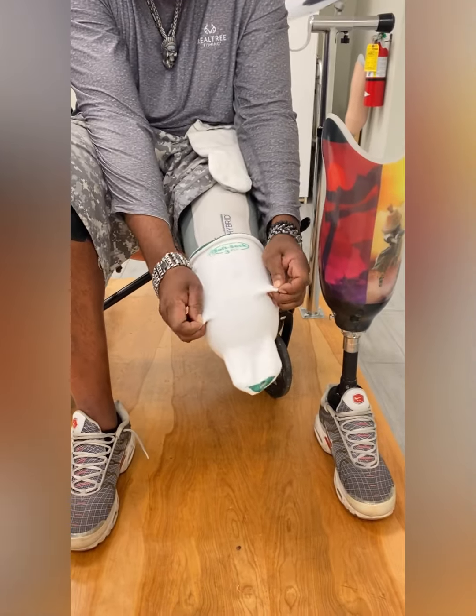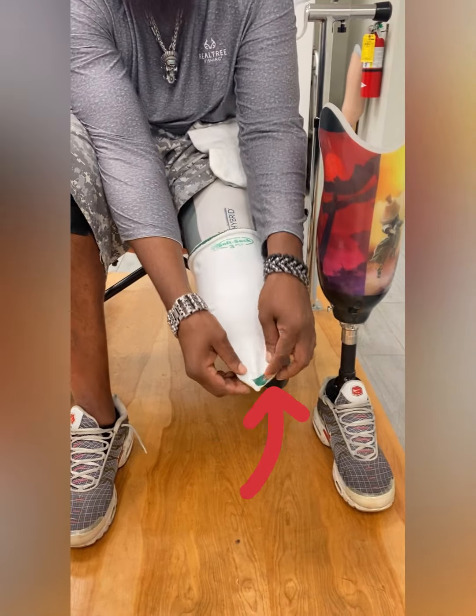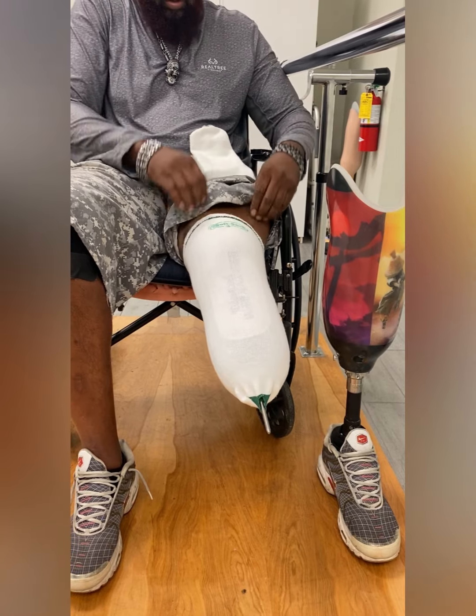When pulling the sock up onto your liner, make sure that you clear the pin from the hole. If not, this could be a catastrophe as the leg could get stuck on and you would need help getting it off. Please refer to another video that we have on how to remove a prosthesis if stuck.